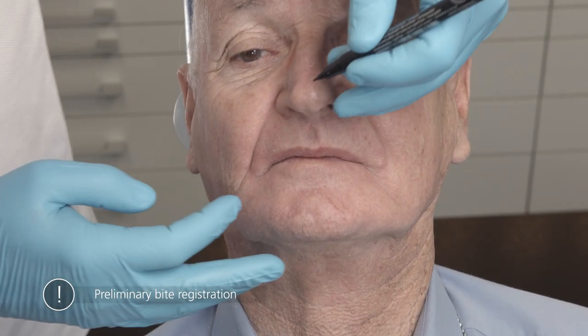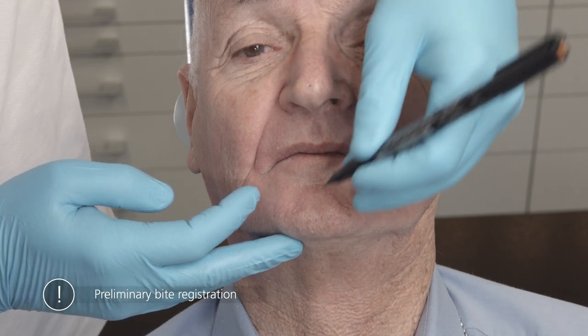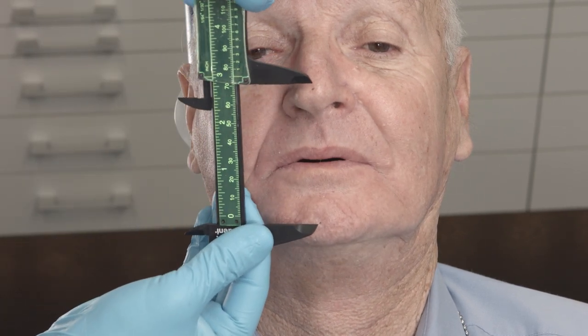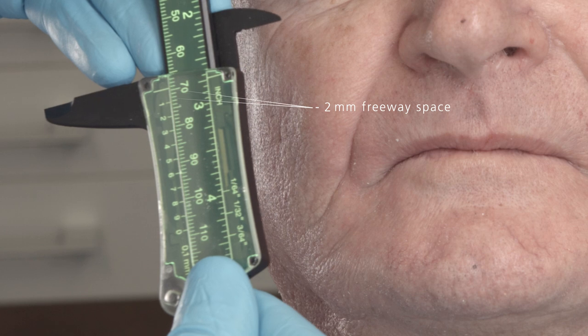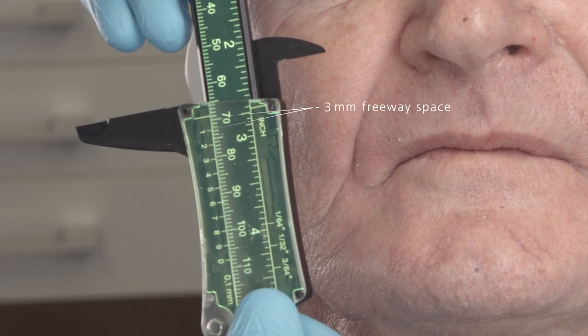Make a mark on the nose and on the chin. Ask the patient to wet his lips with his tongue and close his lips in a relaxed position, then breathe out softly a few times. Measure the distance between the markings and adjust the calipers accordingly. This is the physiologic rest position. Reduce the measured value by the 3 mm of freeway space to obtain the vertical dimension.